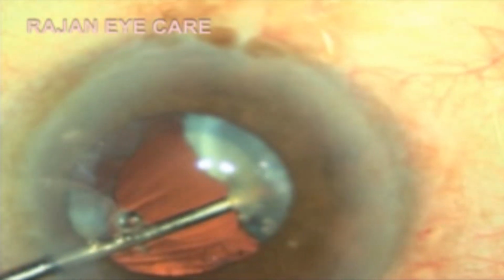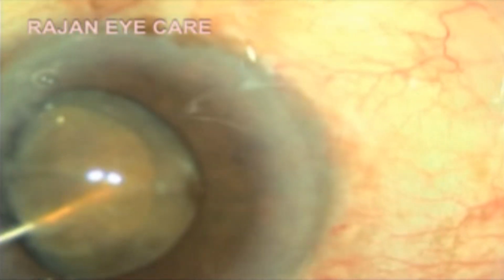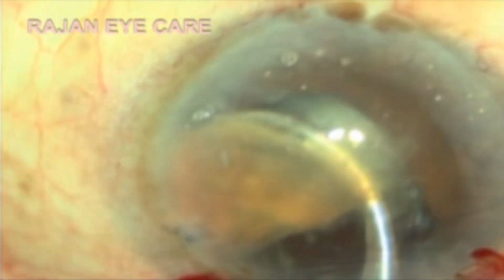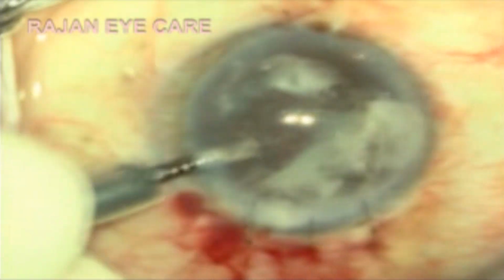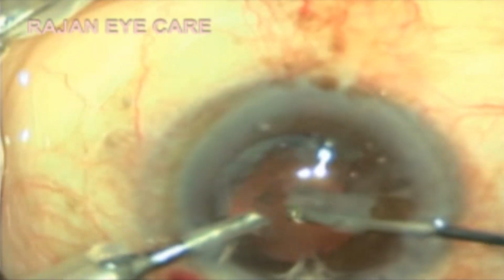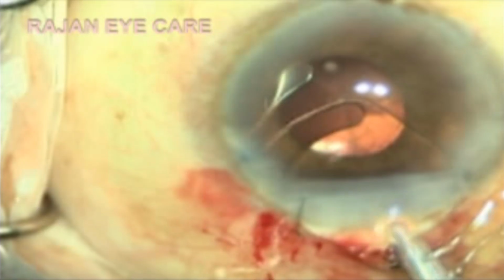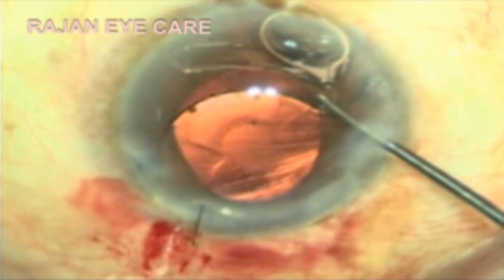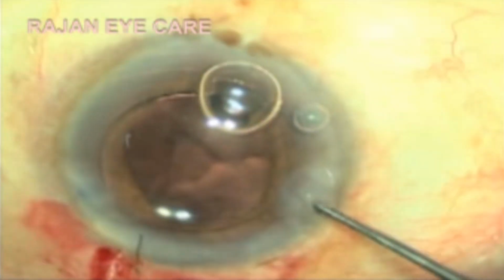This video shows an anterior assisted levitation of the nucleus, wherein the nucleus is brought into the anterior chamber and delivered through an enlarged limbal incision. Preservative-free triamcinolone is being put into the anterior chamber, followed by an anterior vitrectomy and followed by an implantation of an anterior chamber IOL with excellent postoperative visual recovery for this patient.